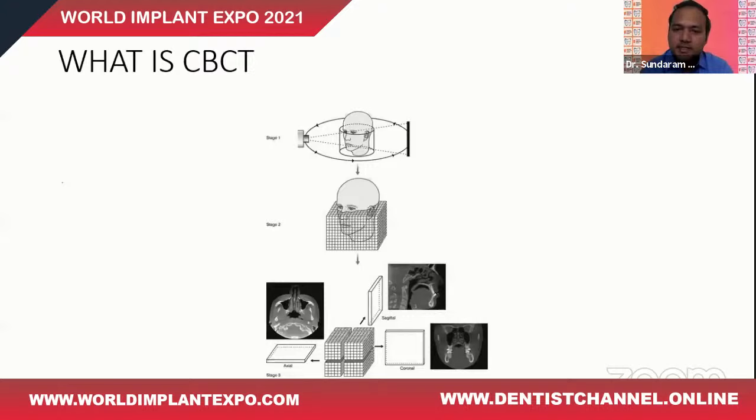Now, what is CBCT? CBCT, as you can see in this picture, has got the patient at the center. The X-ray source is over here, and on the opposing end, you've got the sensor plate, and they keep rotating in all the 360-degree directions. And you could see all the voxels that are being reformatted, and they are displayed onto the computer monitor as axial, sagittal, and coronal images.